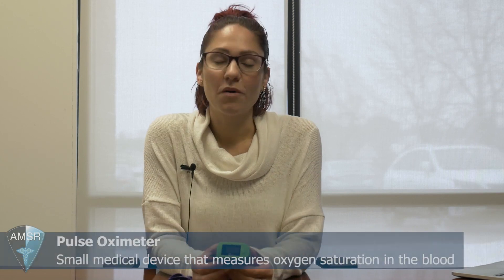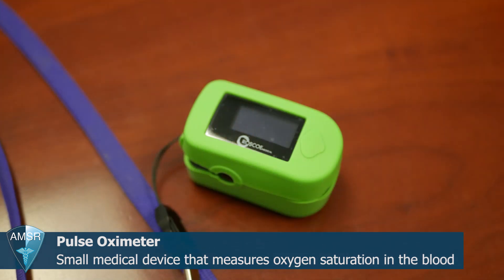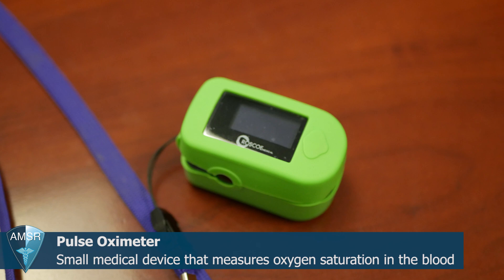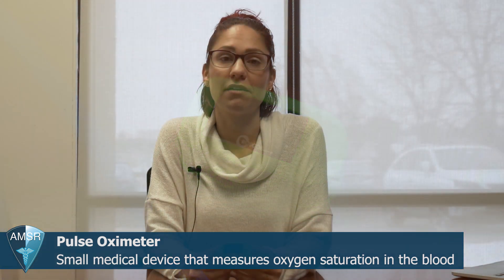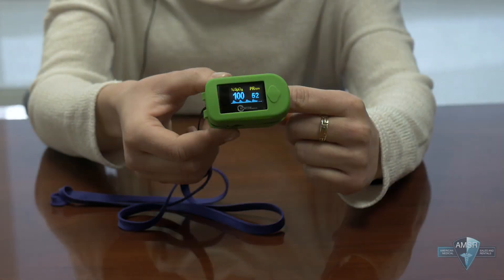Hi everybody, my name is Stephanie, I'm from American Medical Sales and Rentals, the oxygen concentrator store. Today I'm going to talk you through how to use a pulse oximeter and explain a little bit about what exactly it is. A pulse oximeter measures your oxygen in your blood. The goal when using a pulse oximeter is to see where you're saturating — we want you to be above 90; above 90 to 92 is good, and even higher is better.